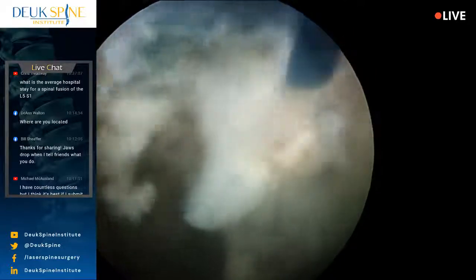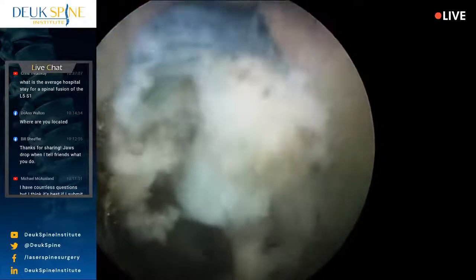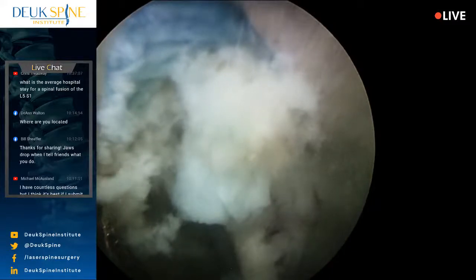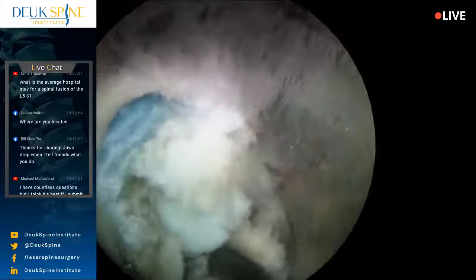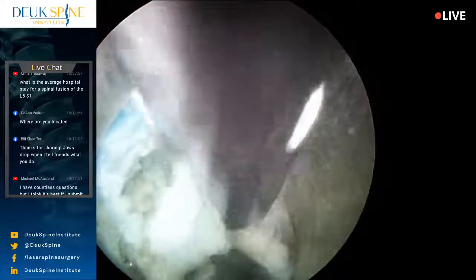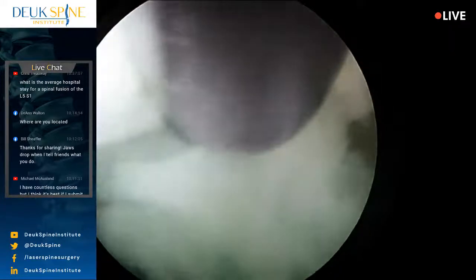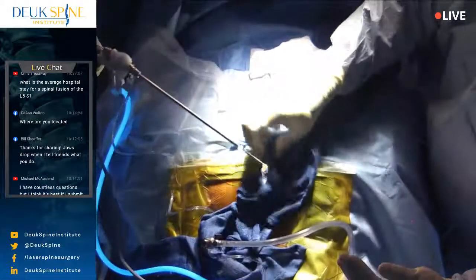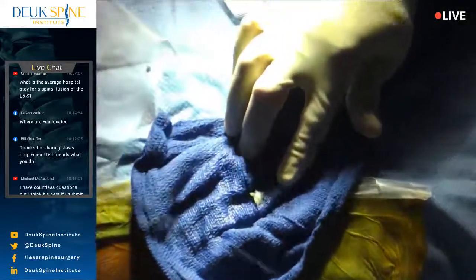Oh, look at that herniation. Oh yeah, baby. All right, it's getting too big for the laser. We're just going to grab it out. Pretty cool, huh? Watching a herniation come out. Oh, that was a good one. Oh, let's look at this thing. It's monstrous. Put the light on. Yeah, we see it. You guys see this thing? Yeah, we see it. It's huge. All right, that is a big herniation.